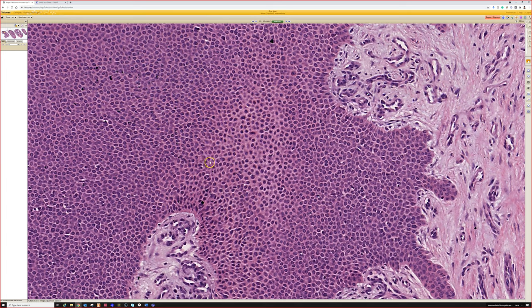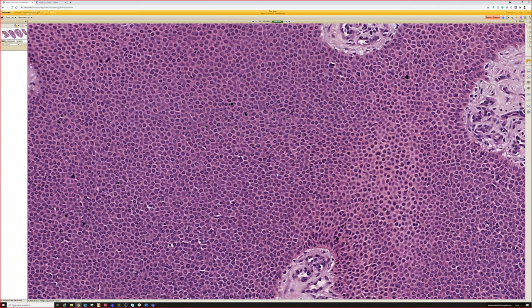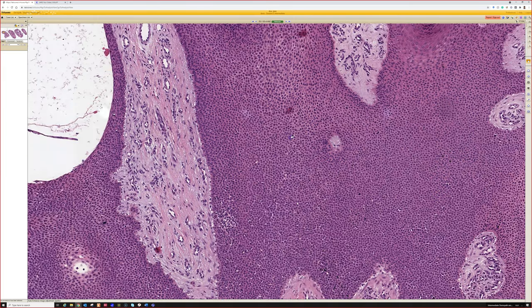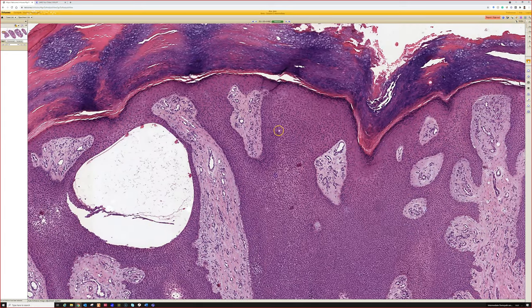Poroma and hidradenoma are part of, I believe, the acrospiroma family. They are very closely related, and just like you can see spiradenoma and cylindroma coexist, I often see tumors that look like poroma on the top, but then when you take the whole thing out, it looks like hidradenoma on the bottom. So the times I encounter that, I'll often say poroma slash hidradenoma hybrid tumor. It doesn't matter. They're both benign sweat gland tumors. And of course, there are malignant forms of both poroma and hidradenoma, but much more rare.